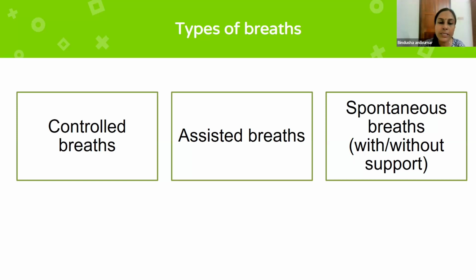And the second type of breaths are assisted breaths. Assisted breaths are initiated by the patient, but the inspiratory time and pressures are actually determined by the ventilator.